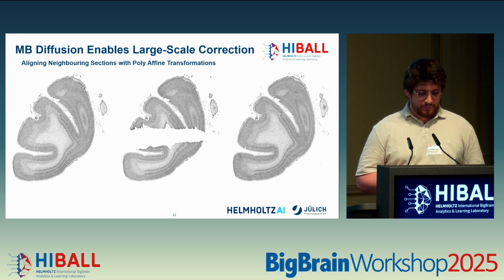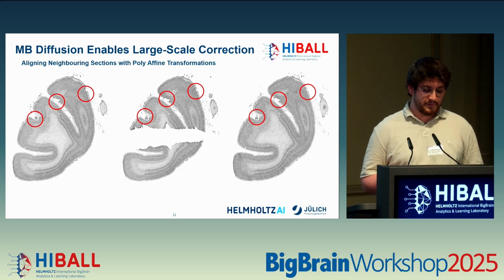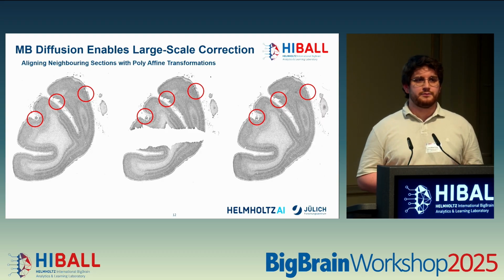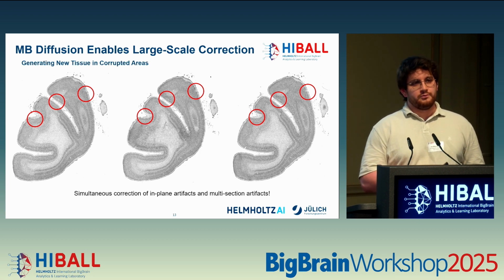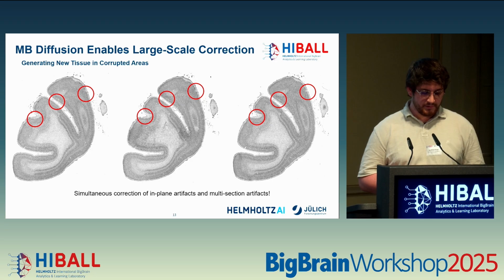And the interesting part about this example is that we actually have 3 more smaller artifacts that occur over all 3 consecutive sections at once. So here we can't just copy the data from one section to the other, but we actually have to generate it simultaneously at once. And if we do that, it actually works simultaneously for in-plane artifacts and artifacts that span multiple consecutive sections, consistent and coherent.